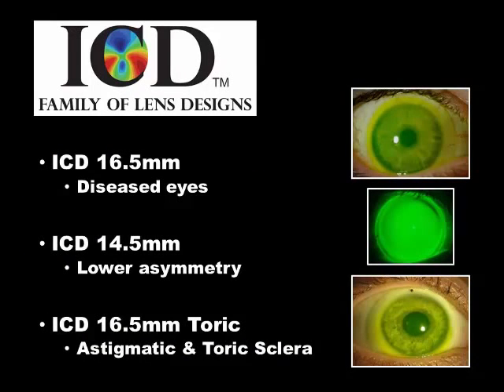So the ICD family has expanded a bit from the original ICD 16.5. You now have the slightly smaller 14.5. You also have the ability to create a toric for astigmatic scleras and for patients with lenticular astigmatism.